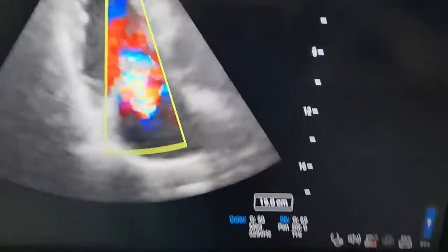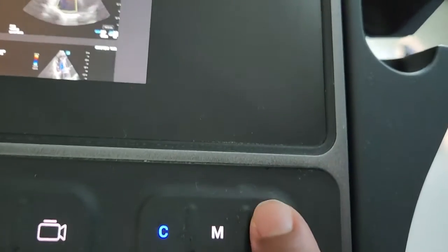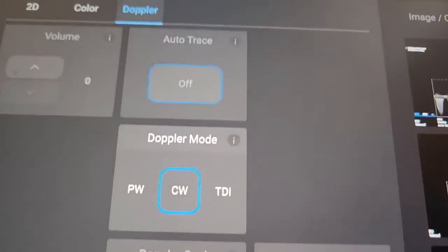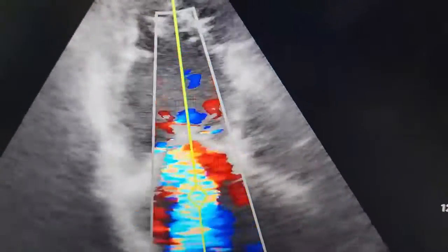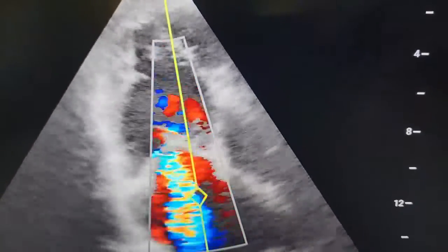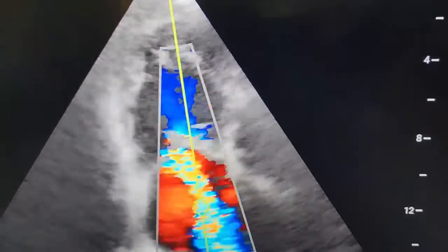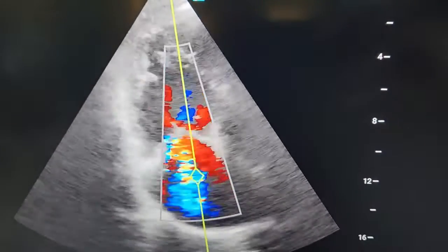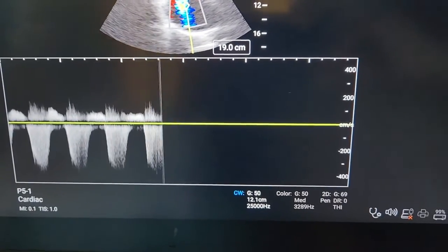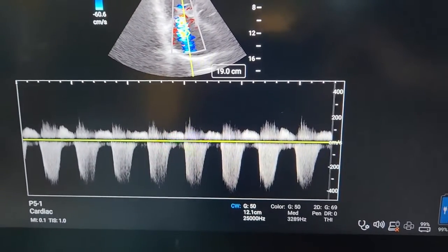If that looks good, next thing we want to do is hit Doppler, and we're going to do continuous wave Doppler, and we're going to put that continuous wave right in the middle.